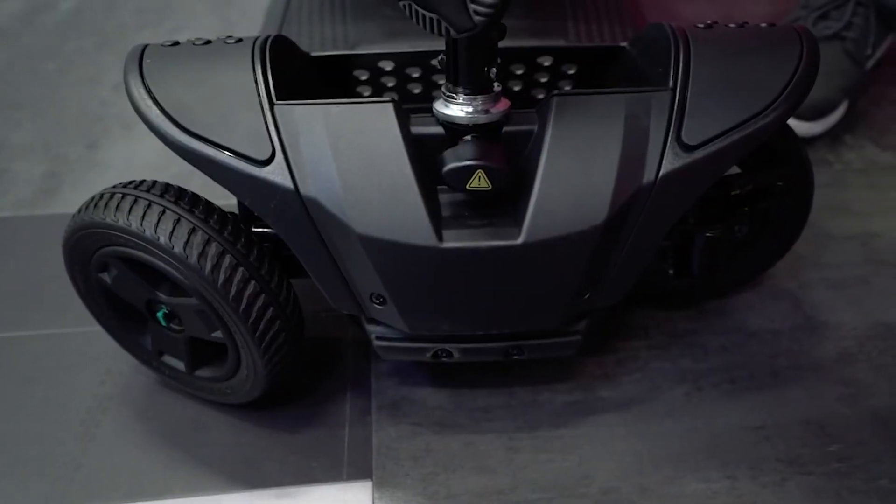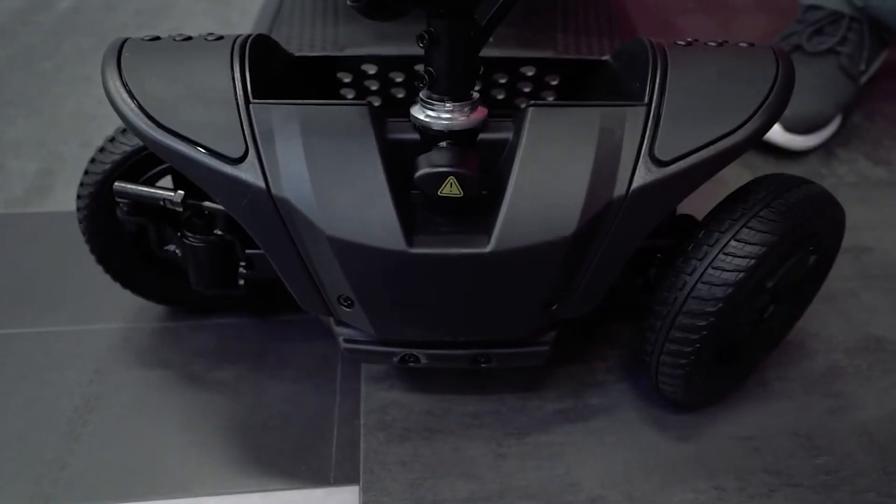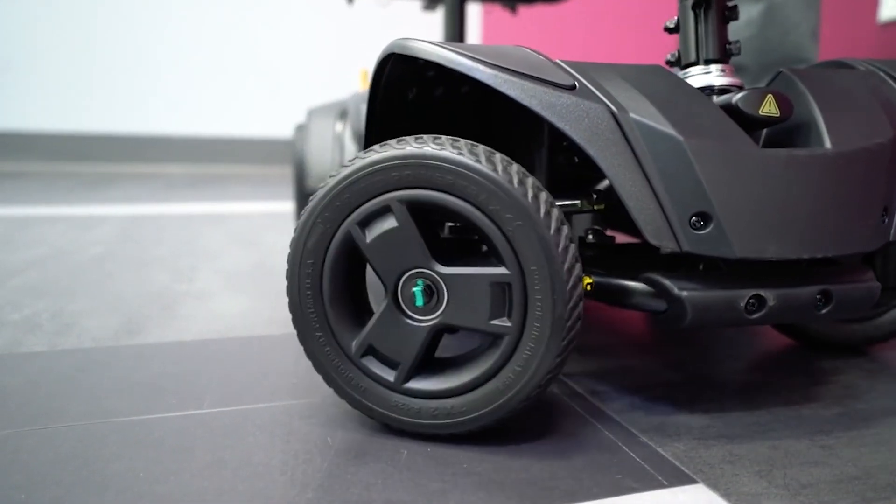Your GoGo Elite Traveler 2 is equipped with Pride's patented i-Turn technology, which offers you the turning radius of a three-wheel scooter and the stability of a four-wheel.